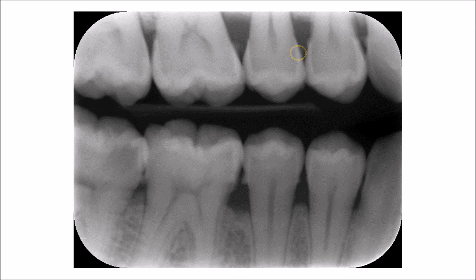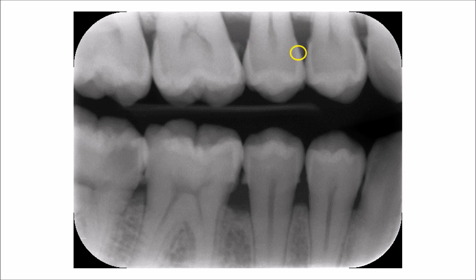In another bitewing radiograph, you can again see the typical positioning of calculus exactly beneath the cemento-enamel junction at the interproximal embrasures, all assuming the characteristic triangular radiographic projections. In this bitewing radiograph, calculus can be seen on many surfaces: the distal surface of the first molar, the mesial surface of the first molar, the distal surface of the second premolar, and the mesial surface of the second premolar.